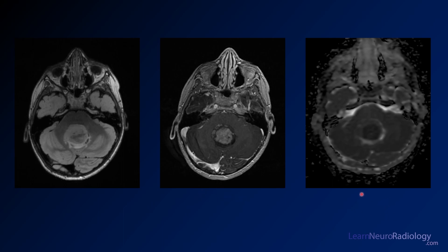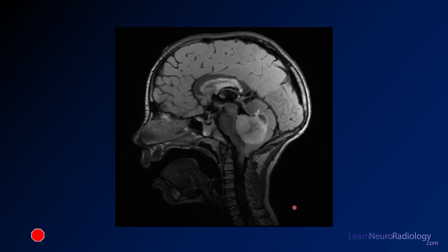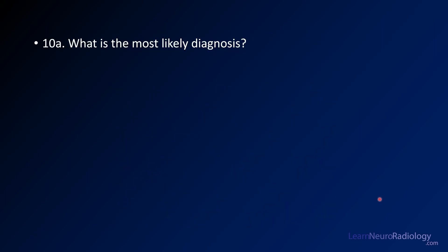And this is an ADC map. Go ahead and get your bearings for where this abnormality is — think about where it might be arising from. Here we have a sagittal FLAIR from a 3D FLAIR through the same region. This can give you a little bit more information about where you think that thing is originating — whether it's originating in the fourth ventricle, from the brain stem, or from the cerebellum.